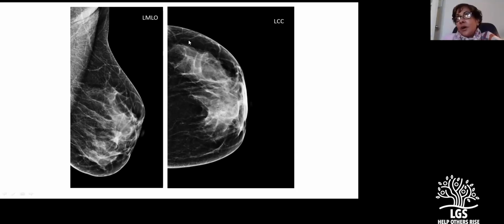And unfortunately, we don't do MRIs, but I'm telling you, I do most of my biopsies using ultrasound, because those calcifications I would have seen on ultrasound. You could have done it on the ultrasound, the way we do it. But anyway, you have to do it the way you do it. I'm just saying, we can't compare. We have to compare the ways we do stuff.